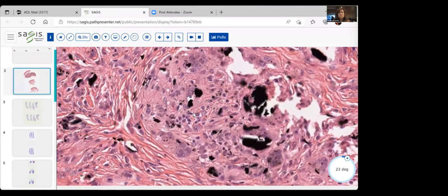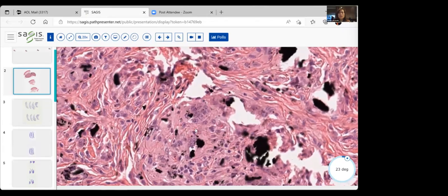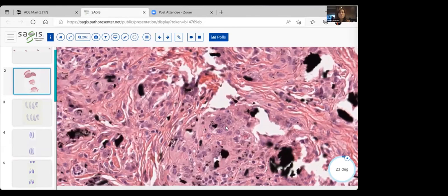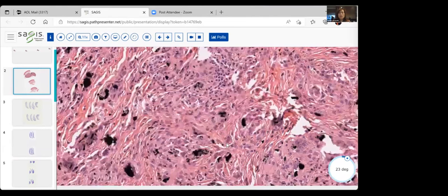eat this up. To do so, sometimes they will form big cells, multinucleate cells, as a matter of fact, and you can see that here, for instance, right in the middle, multinucleate giant cells with that graphite material here that they're trying to collect and remove. Over here, look, this wonderful example, multinucleate giant cell with graphite material within the cytoplasm. So it's engulfing it, it's eating it, it wants to take it away. Looks like it has a big job ahead of it though, because it's quite a bit of material.